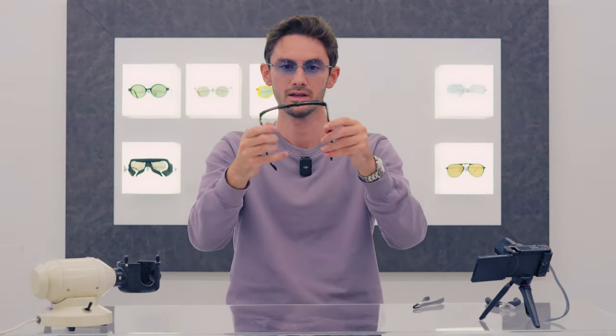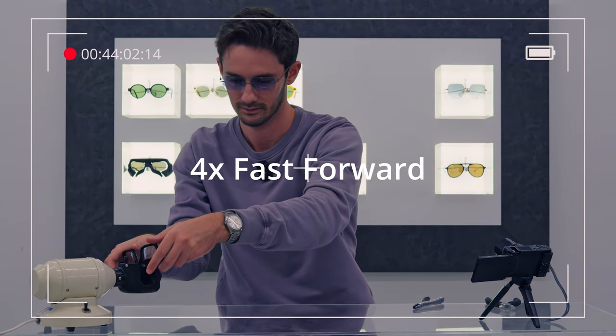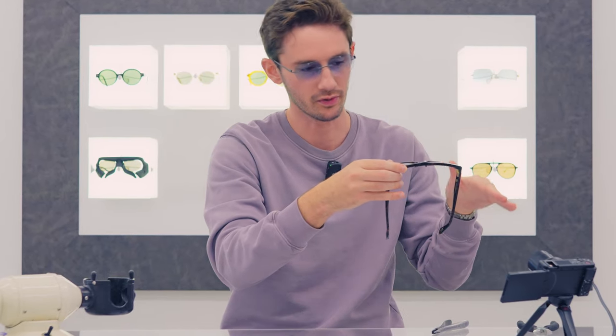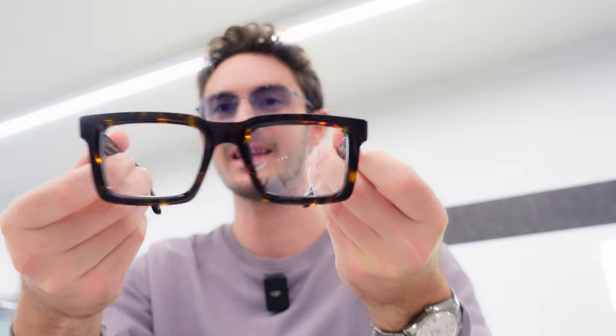The bow angle can be done on an acetate frame as well, simply by heating this area here. Acetate is such a beautiful, magical material, and there's a reason why it's used in the best quality frames — because acetate is so mouldable and malleable when heated, but then retains its shape when cooled. So that means you can introduce a bow angle even to the thickest acetate frame, with the right skill, the right tools, and of course the right glasses.